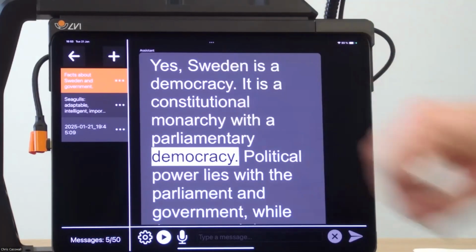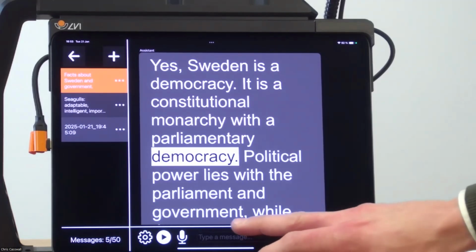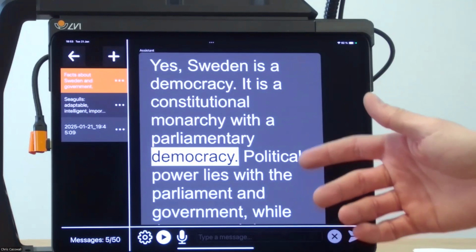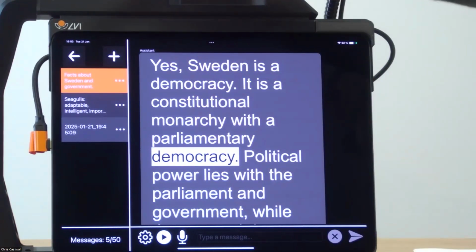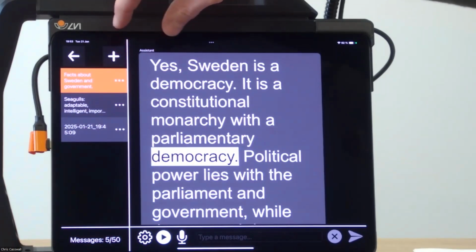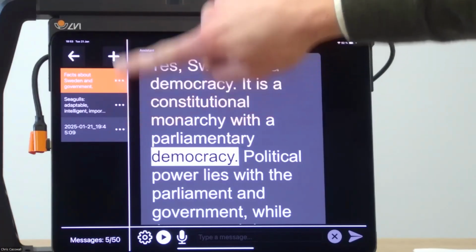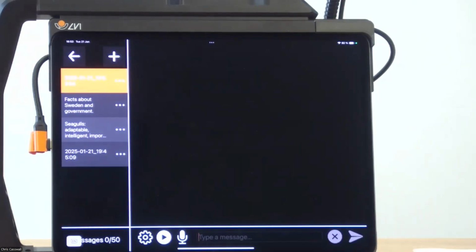And you do have the low vision basics of the features where you can do high contrast, magnify the text here, and so on. I'm still in this conversation that I started by scanning and bringing over the text that was under the camera, or I can go out to the left part of this view where the menu of my conversations is. I know I started one earlier, but I'll start a new one here. I'll start a blank conversation.